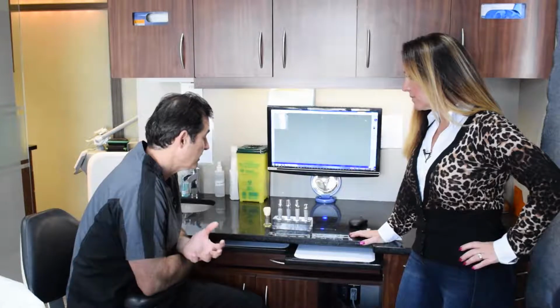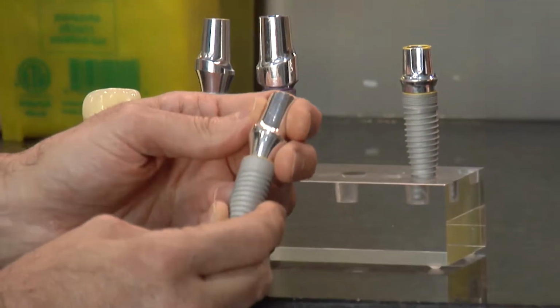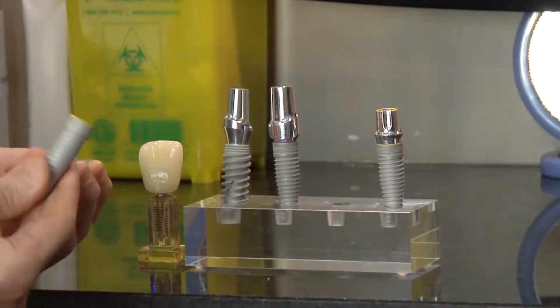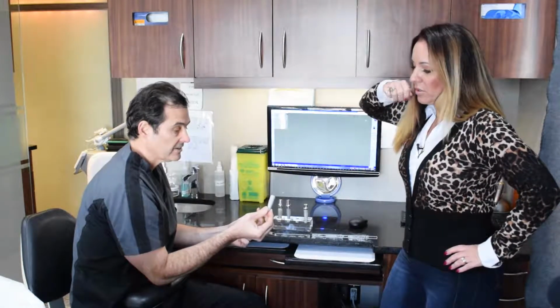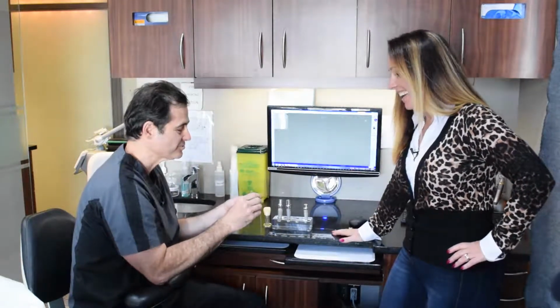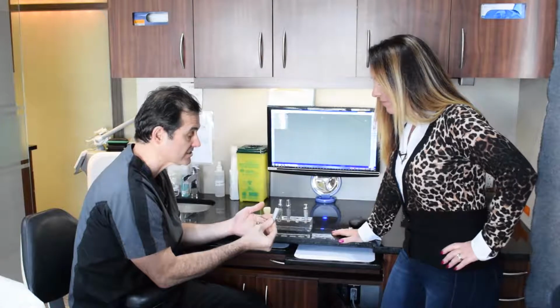So basically what an implant is, it's a metal screw. On this little model here, I'm showing a bunch of different screws that one company has. So basically this is an implant, and that just screws. We just put this into your jawbone, except that they're not that big. This one is for a gorilla or a dinosaur, but this is not for a human. But anyways, just to give you an idea, that's what an implant is.